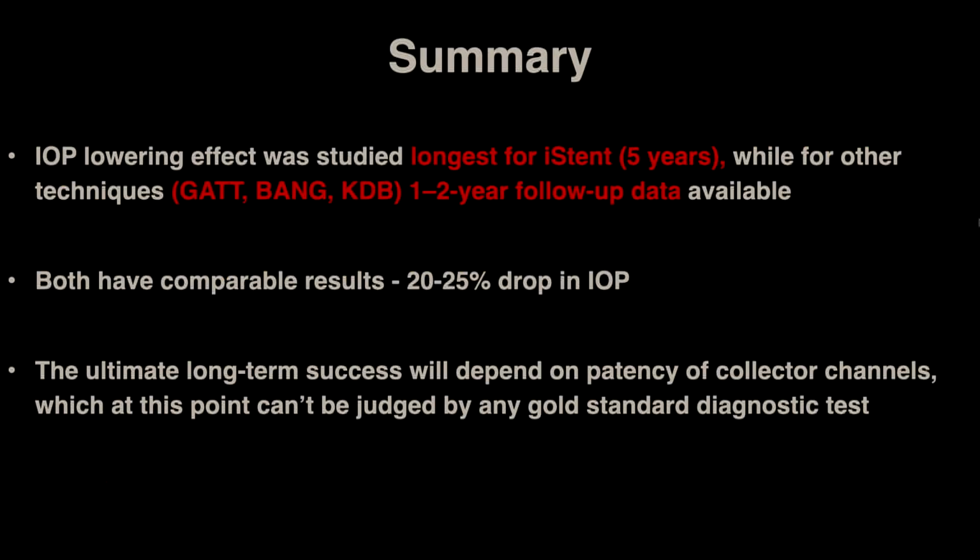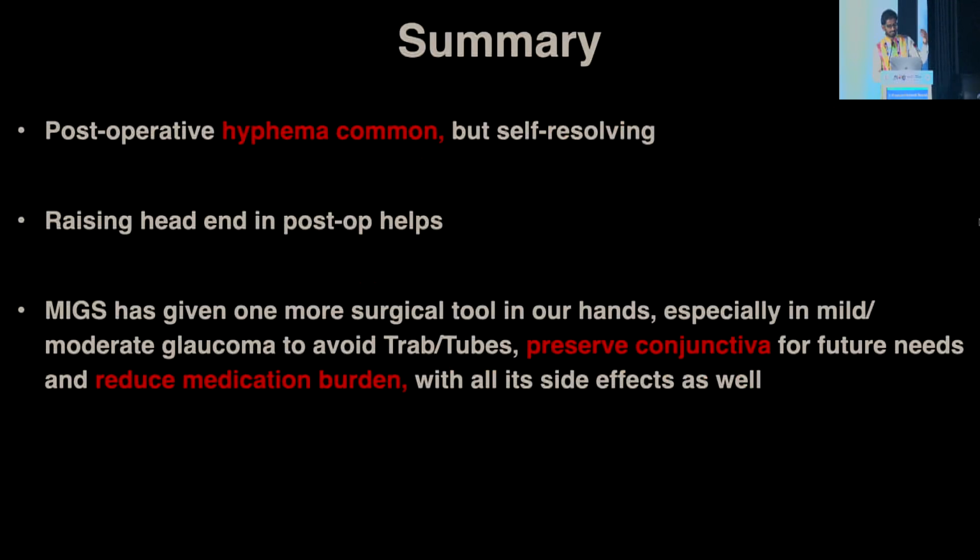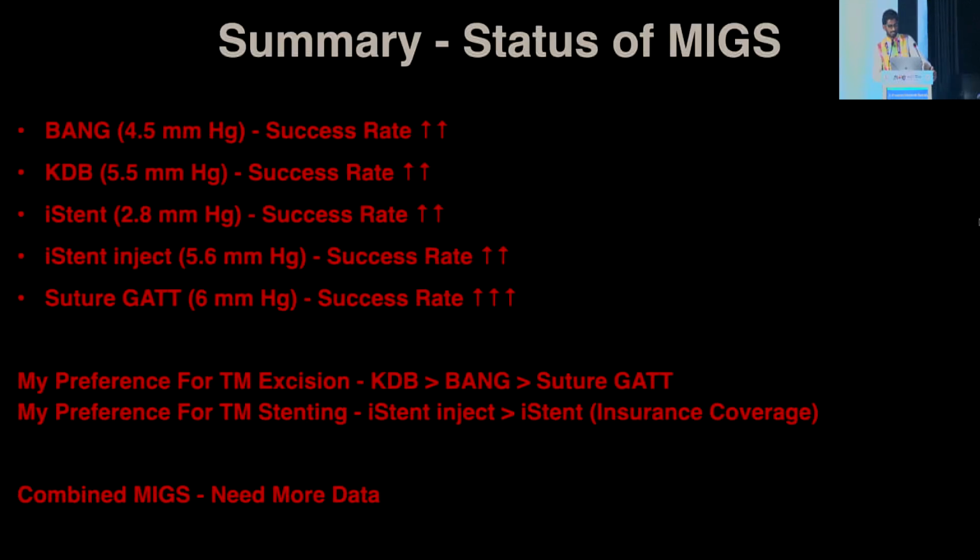To summarize, what anti-VEGF is doing for retina, I think MIGS is doing for the glaucomatologist. And these are some of the observations that I have made, a personal take that works well in my hands. I think with more time we'll know better how each MIGS is functioning. With more data, more randomized controlled trials and more multicentric trials, we'll be taking things forward.